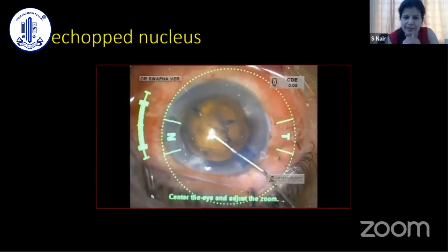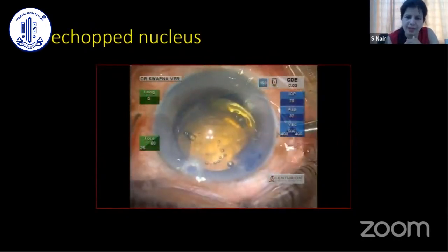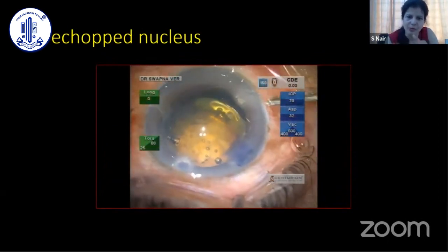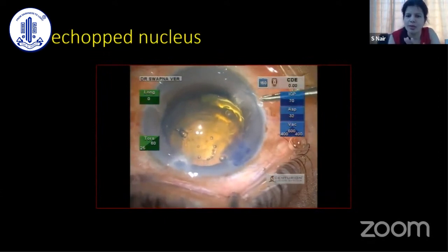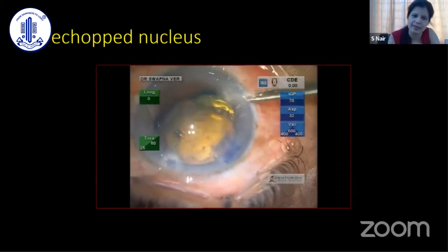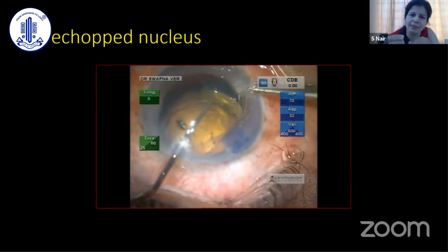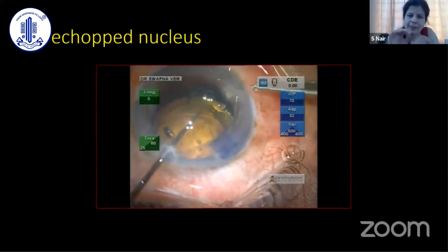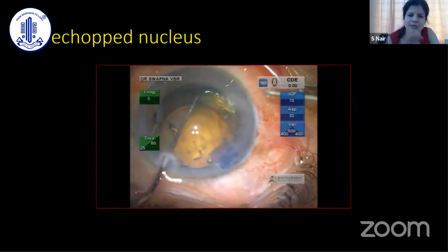Now, this is the patient on the table. You can see how the free-floating rhexis comes out, and all you need to do is a good hydro so that you can pass your CTR in. So there is no way out of a CTR or a segment. It's only that some parts of the surgery are made much easier, but the application of a CTR or a CTS is inevitable in most cases of subluxations.